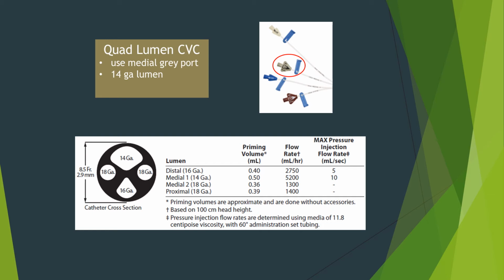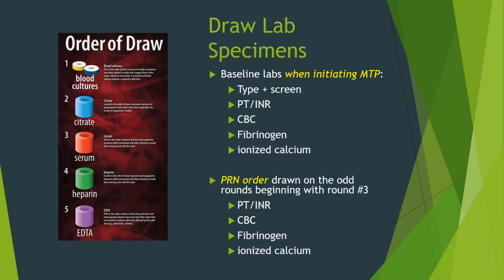As the picture indicates with the red circle, you will connect the Belmont Rapid Infuser administration set directly to the hub of this port. You will remove the clave and connect the tubing directly to the hub to reduce resistance and achieve optimal flow rates.